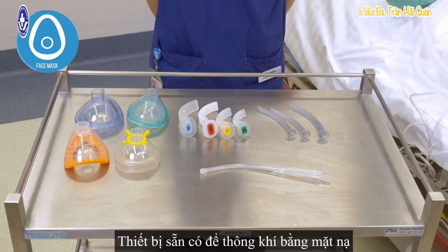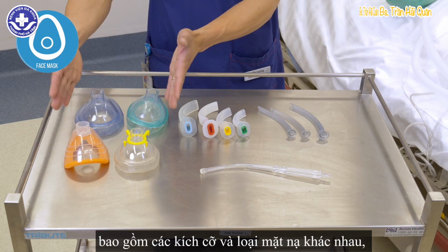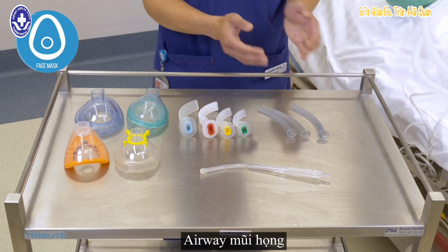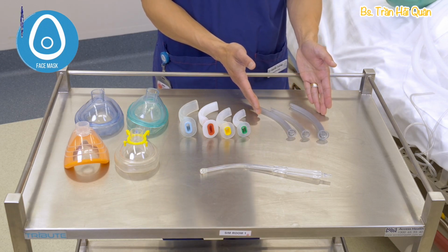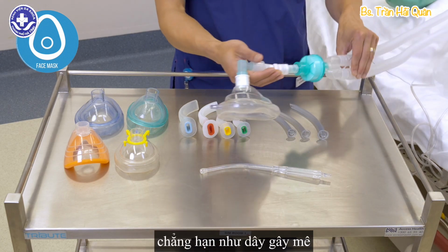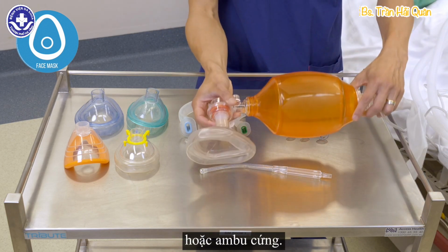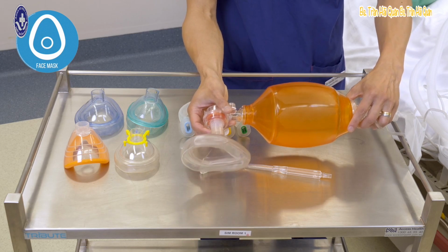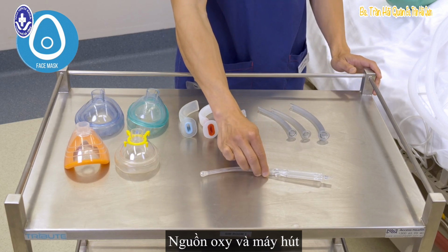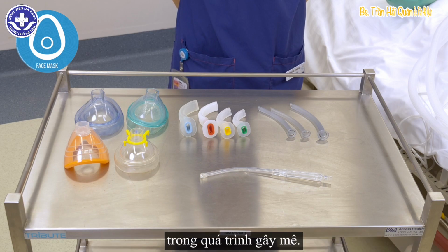The equipment available for face mask ventilation includes different sizes and types of masks, oropharyngeal airways, nasopharyngeal airways, and methods of providing positive pressure ventilation, such as an anaesthesia circuit or a self-inflating bag. An oxygen source and suction equipment is essential for all three techniques of airway management during anaesthesia.